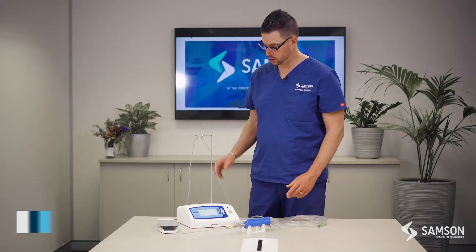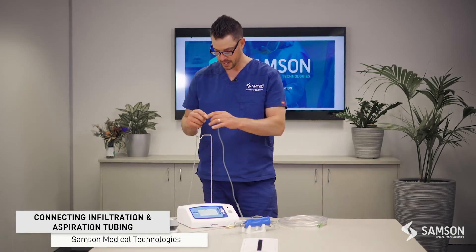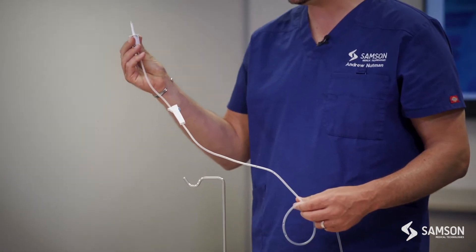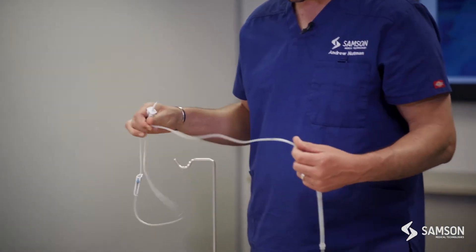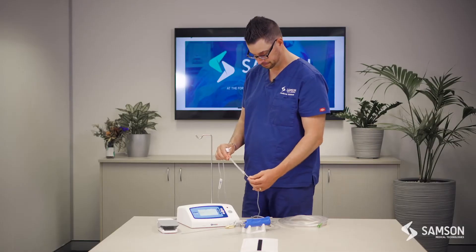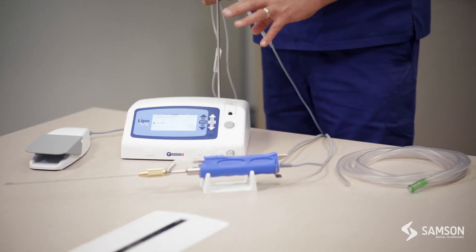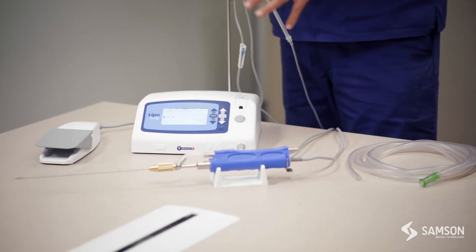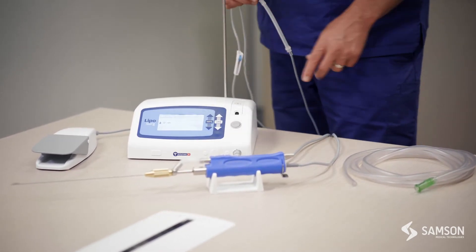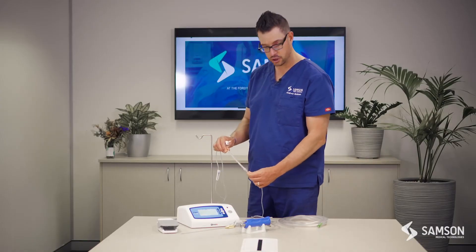Connecting our single-use infiltration tubing and aspiration tubing, we make sure the IV bag is inserted here, then the tubing runs down into the system. The LipoSurge is a built-in all-in-one system with the infiltration aspect of the device and a motor to run the power-assisted liposuction as well.